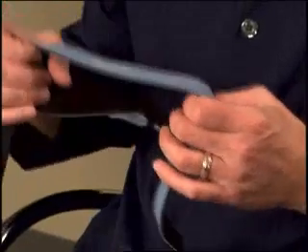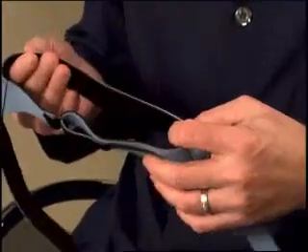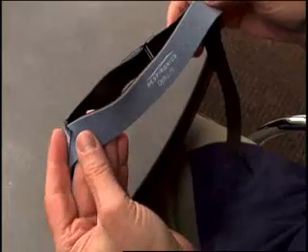For proper positioning and attachment, the Respironics logo and OptiLife name should appear on the back of the headgear, right side up.